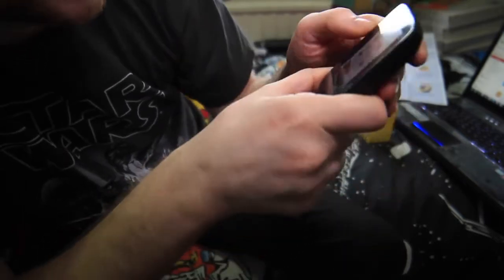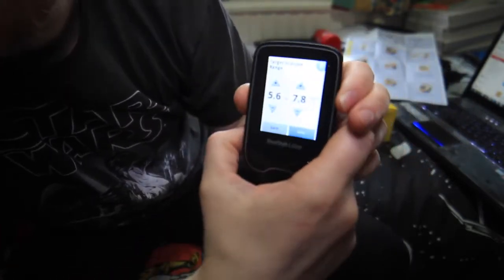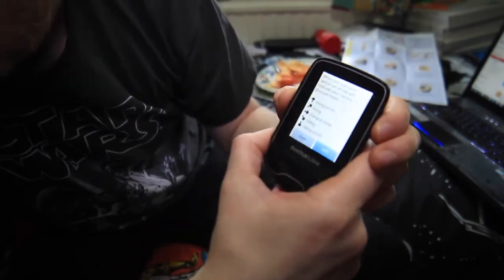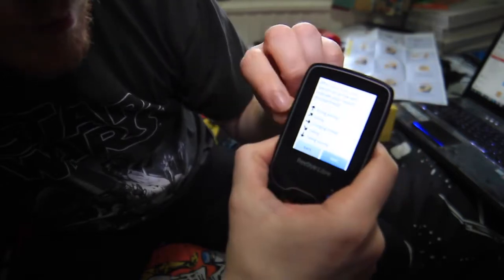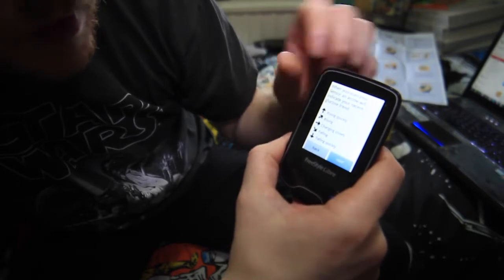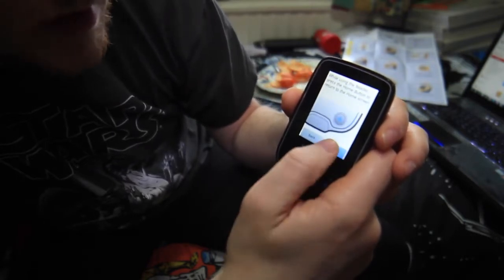It's asking me for my target glucose range — I'm just going to click next and leave it as the standard. It says an arrow will indicate your recent glucose trend: pointing up means rising quickly, to the side means changing slowly, and going down means falling quickly. I'll click next. While using the reader, press the home button to return to the home screen. Done.